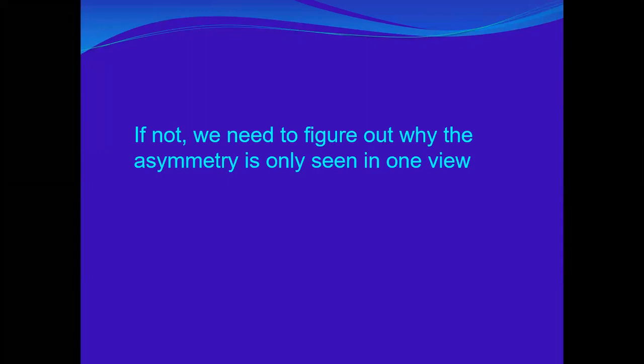Just report it as asymmetry, or do I have to clarify?